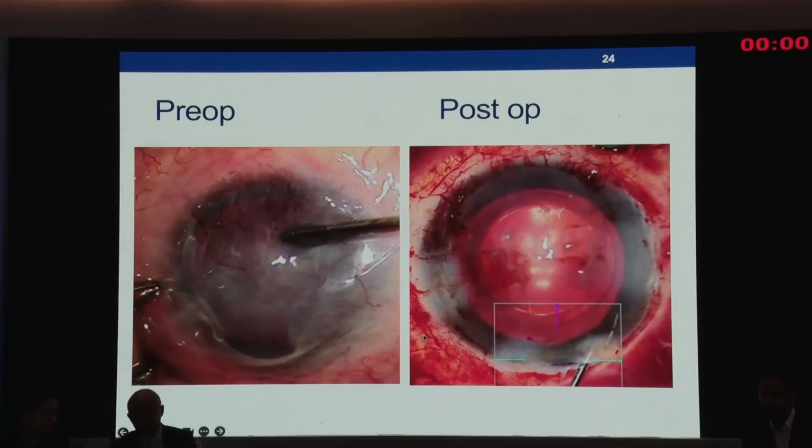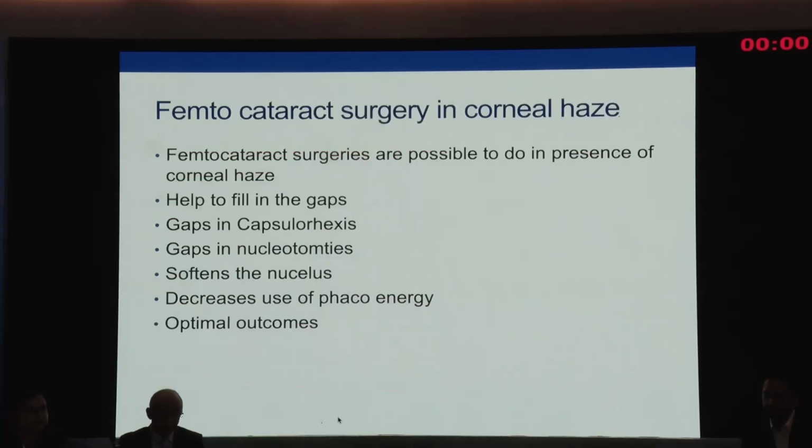Sometimes, like I say, you have to dig it out to see where the patient can see from, because the patient hops from surgeon to surgeon, but if nobody does a case in these eyes like this, then we will not be able to give vision to the patient.